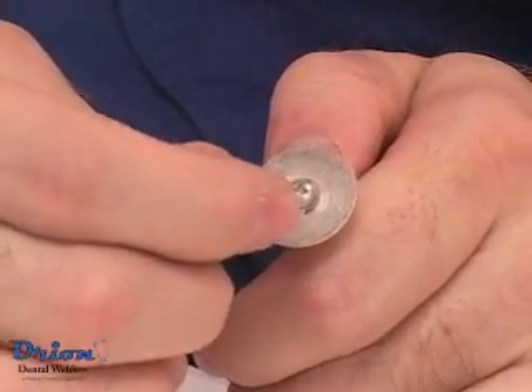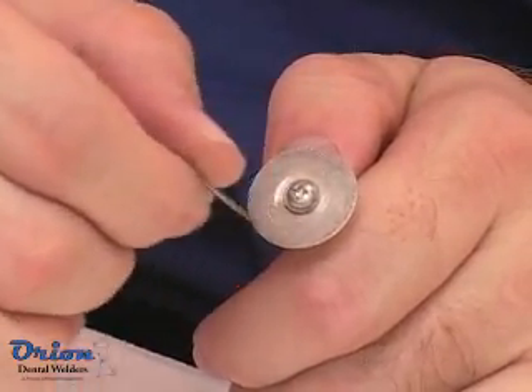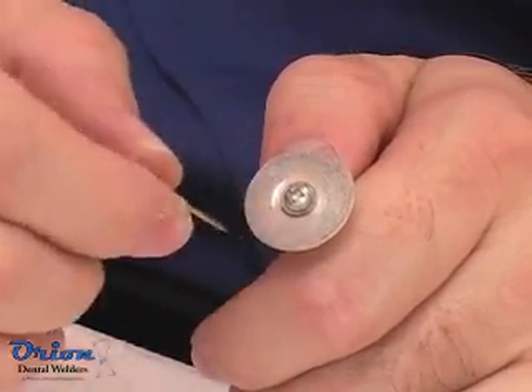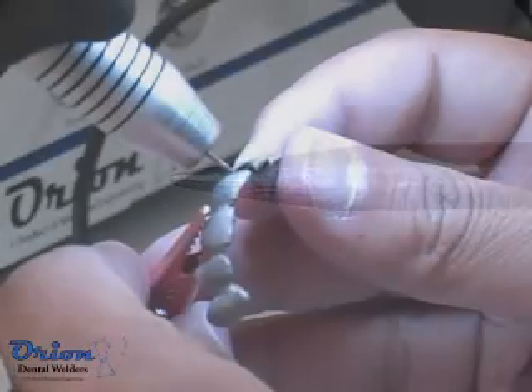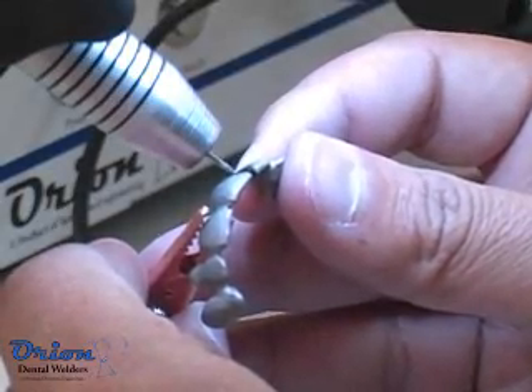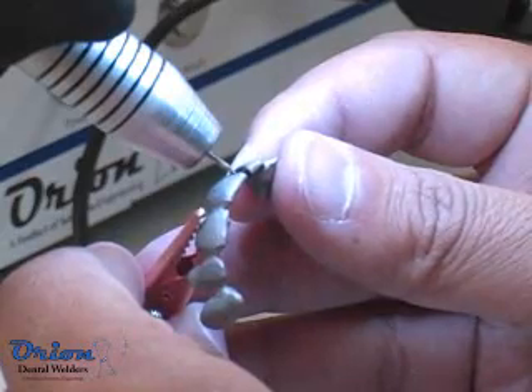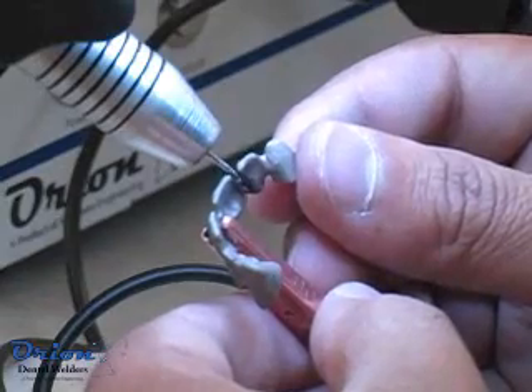Place a very small flat on the electrode tip to improve welding properties. This flat should be extremely small or non-existent when welding fine features, and can be enlarged when welding with more energy. For very small parts, a very small flat or no flat can produce a great weld. When using higher power settings, the flat size may need to be increased to prevent pushing the metal around.